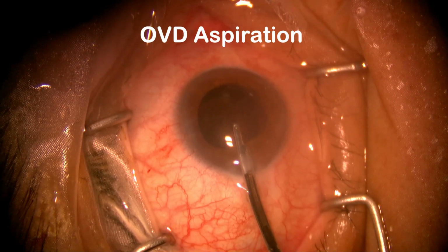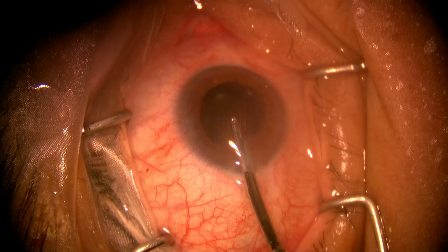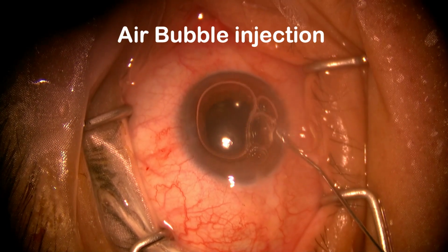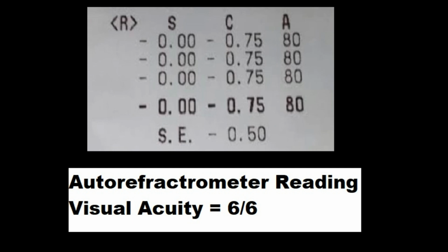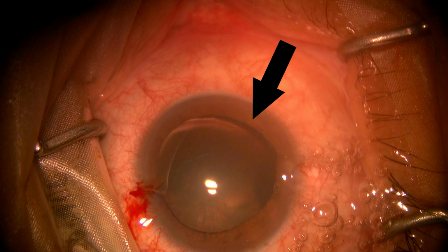Leftover viscoelastic substance in the anterior chamber is being aspirated using irrigation and aspiration by a Simcoe cannula. A single and well-centered air bubble in the AC rules out the presence of vitreous in the anterior chamber. This is the AR reading of this patient who is happy and satisfied after surgery. This was the position of the bag, as the bag did not have support of zonules.